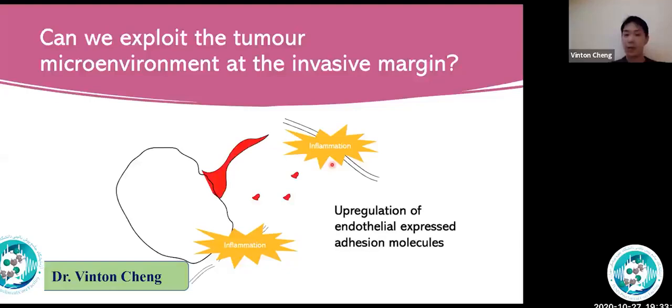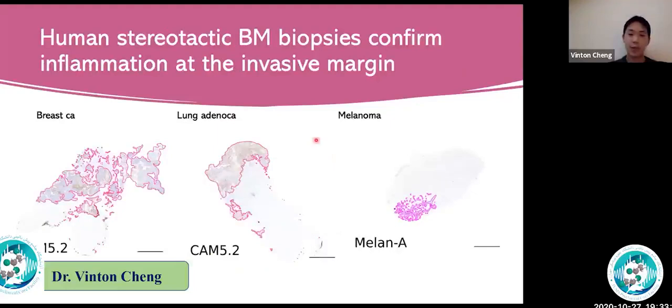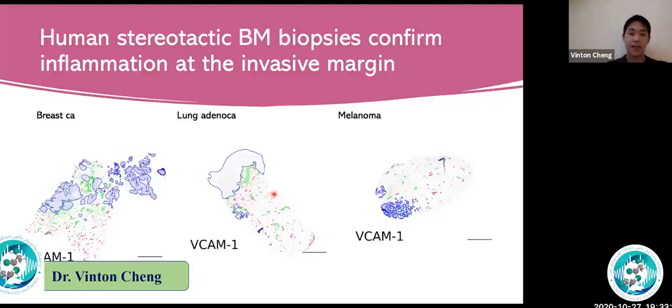And so we were fortunate in our collaboration that we had these biopsies which were taken right in those edges from where they thought they could see the edge of the tumor. And here you've got three representative biopsy samples. This is unpublished work, which we're getting ready to publish soon, with tissue of brain metastases, which I've outlined in pink here, with some normal tissue adjacent to it. So this is tissue which doesn't have any tumor cells inside. And you can see here, we've got a good model where we've got a cluster of tumor and some adjacent parenchyma. And we interrogated this to look at VCAM1 expression.